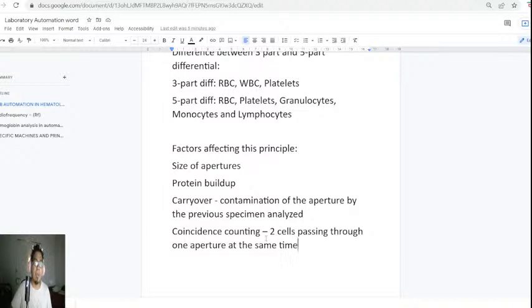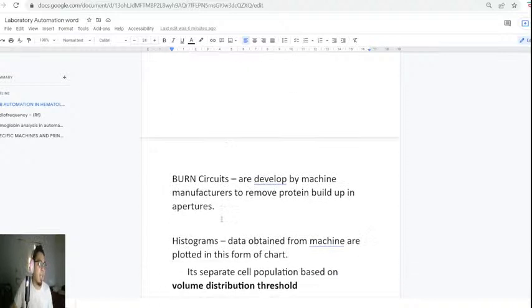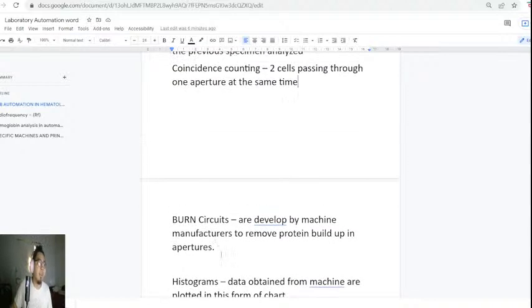Well, first of all, we gotta check the patient's condition. There are some cases where microcytosis occurs, like extreme microcytosis, or giant platelets can be counted as WBCs or as RBCs. Okay, so be mindful of these things because this can result in an anomalous histogram. All right. Speaking of histogram, we're going to talk about that later.